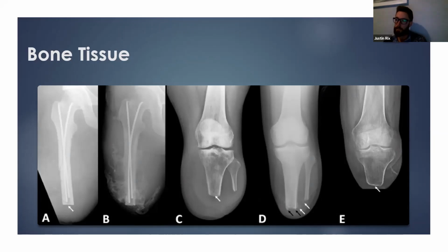Again, if the fibula is left longer than the tibia, we have an issue at the distal end, and it makes weight bearing quite difficult. Again, socket modification can be attempted, but often surgical revision is necessary in that case. In very short transtibial residual limbs, if the fibula head and the shaft are unduly prominent or hypermobile, the fibula at least may require secondary resection in that case.